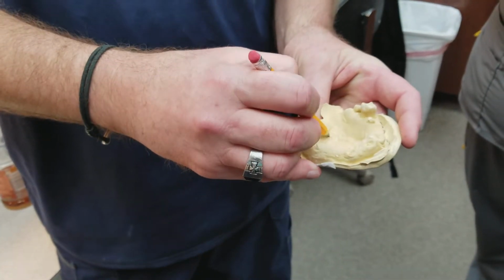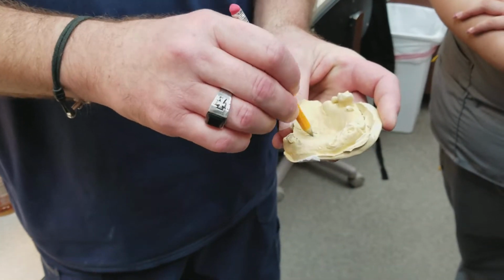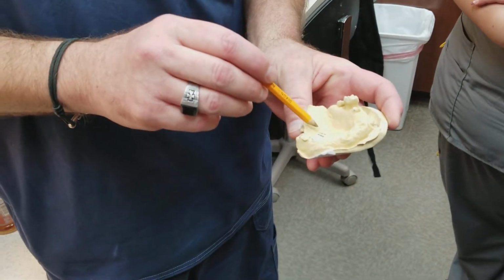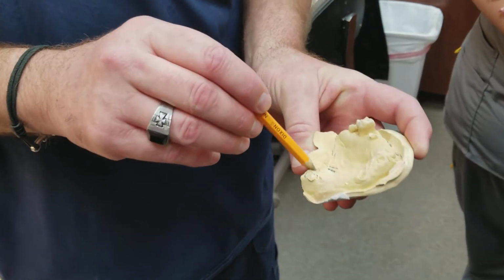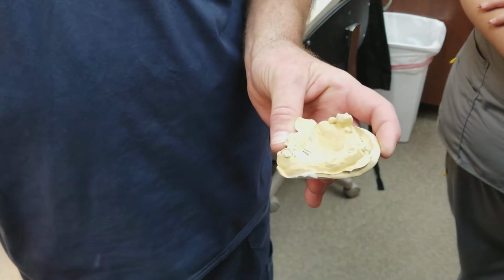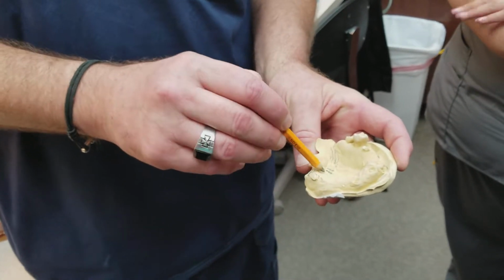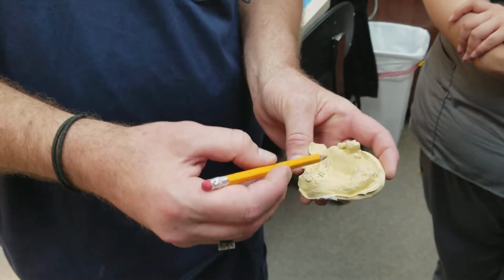Okay, your fovea palatina, and you can see it. There's like two little dots in the patient's mouth. Sometimes it's not really prominent, but you can see it if you look. And so we need that area. And so when you connect to there, that's where the back part of your removable denture or any appliance, flipper, it could be anything, would go. And then your soft area, which is your palate. Okay, your soft palate area. That's where your post dam would go. So we need all those areas.